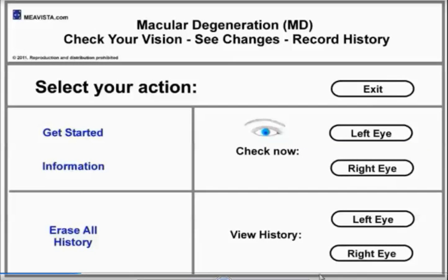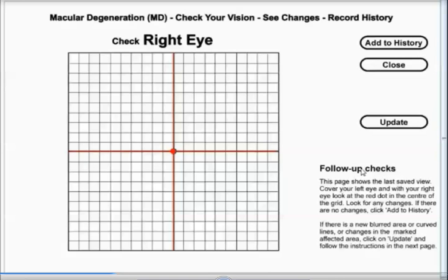Let's give an example of how you can test your eyes. First, push the button of the eye that you want to check. In this example we'll start with the right eye. If you see no curved lines or blurred area, click on add to history.